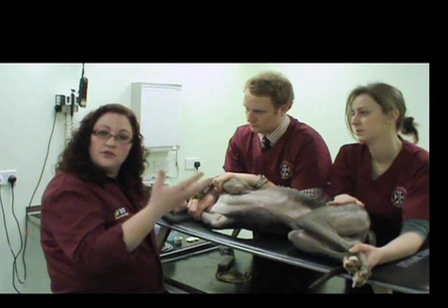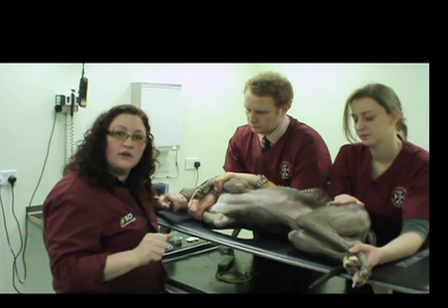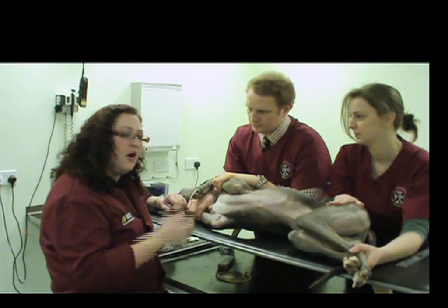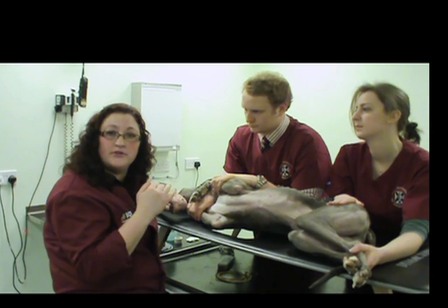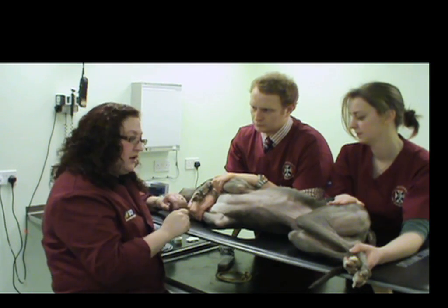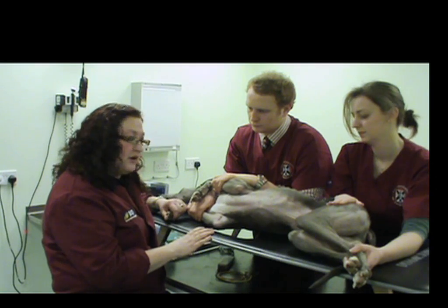If it's somewhere that the door won't be opened and closed continually, and is hopefully not right next to the main waiting and reception area, that can be very helpful. It's also important that the room needs to be able to be dimmed — so the lights, and if there are any windows in the room, that they can be covered over. All of these things will help you to get more out of your examination.